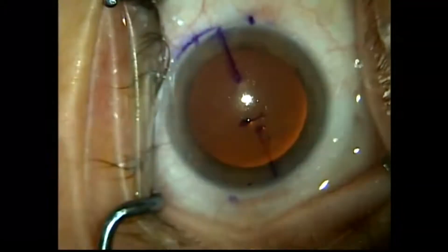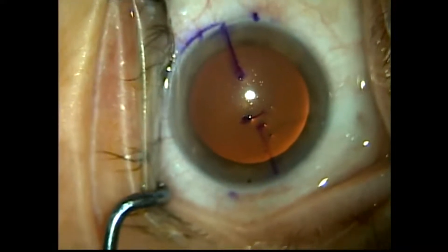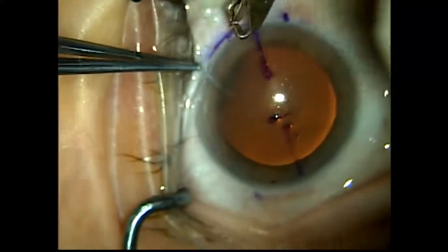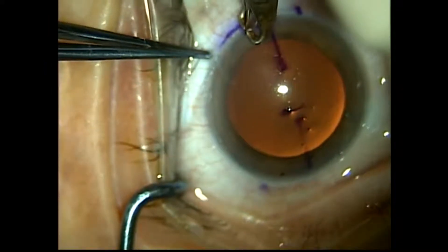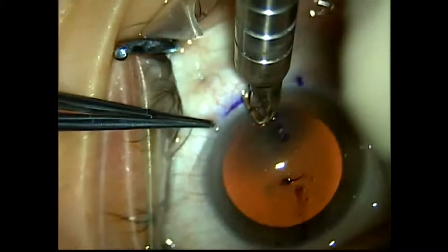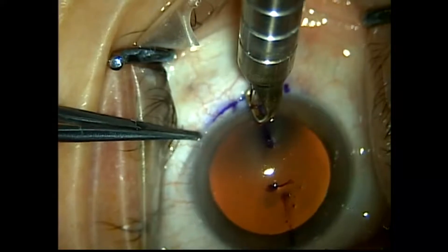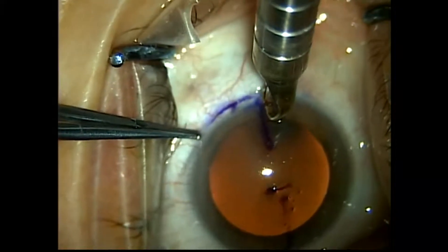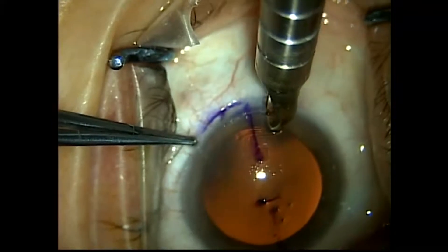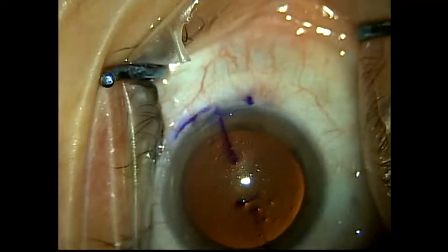I'm going to create my 4-millimeter limbal relaxing incision with topical anesthetic. I'll grasp the conjunctiva and then incise the cornea, using the 0.12 forceps as counter traction so the eye does not rotate away from me or torque while I'm making the incision. I usually make one pass and then double check it.